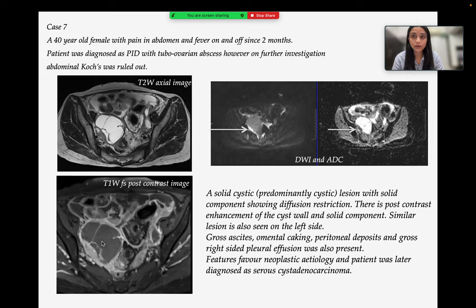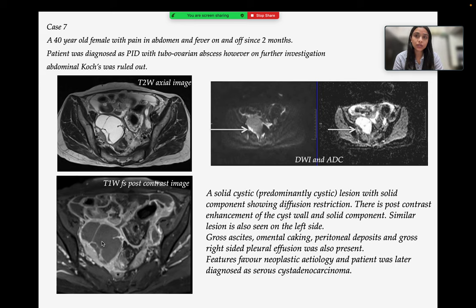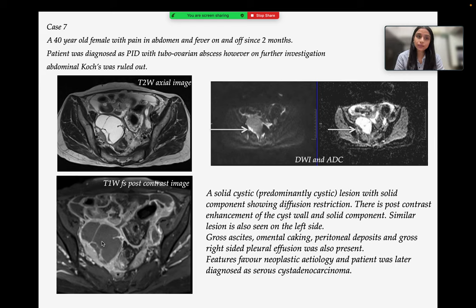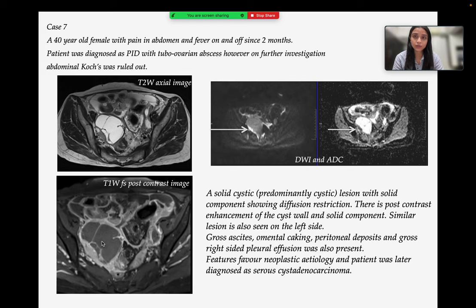Case 7 is a 40-year-old female with pain in abdomen and fever on and off since 2 months. The patient was first diagnosed as PID with tubo-ovarian abscess; however, abdominal Koch's was ruled out on further investigation. MRI showed a solid cystic lesion with solid component showing diffusion restriction, post-contrast enhancement of the cyst wall and solid component. A similar lesion was also seen on the left side. Gross ascites, omental caking, peritoneal deposits, and gross right-sided pleural effusion were also present. Features favor neoplastic etiology, and the patient was later diagnosed as serous cyst adenocarcinoma.